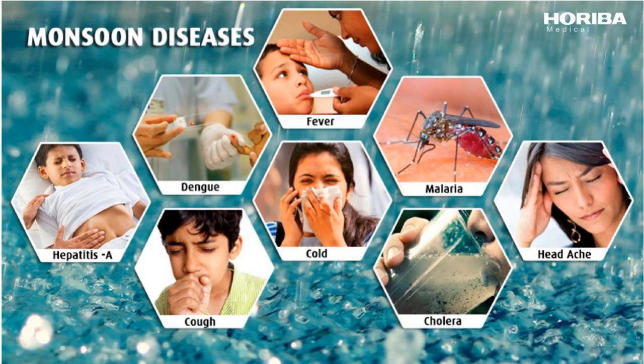And we would all agree that to diagnose the cause of fever, a plethora of tests are available. But the most important and easily accessible investigation is the hematology analyzer. CBC is a well documented and reliable tool for screening and monitoring of infections, and is being used as the first line of investigation for almost all medical conditions. The new parameters developed on the hematology analyzers, like malarial flagging, dengue flagging, CRP, NLR, GLR, are giving a new dimension to the field of diagnosis. So how good these new parameters and flaggings are, how important and how useful they are, let's explore all this in detail.